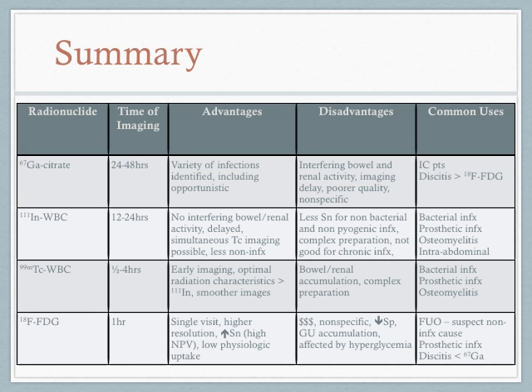Gallium citrate these days, most commonly used for chronic infections such as discitis, is actually better than PET scan. And gallium also in immunocompromised patients because they may not have enough white cells to tag and inject back into the patient. Indium scan best again for intra-abdominal infections. Technetium for a lot of other indications that indium would also be recommended for. The problem with PET scans so far is the cost and decreased specificity.